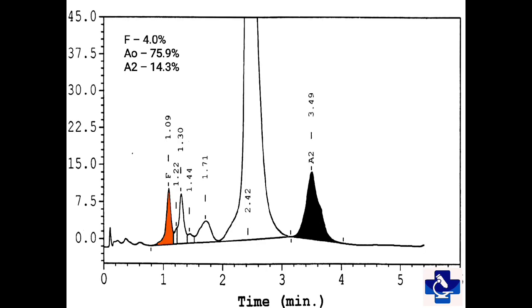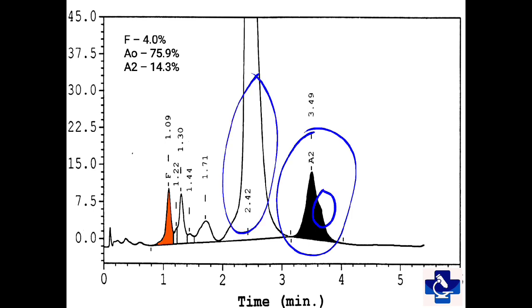In this slide, we can see that A2 is elevated at 14.3% with a bulge on the downward slope of A2. A0 is the major hemoglobin fraction at 75.9%, with slightly elevated fetal hemoglobin at 4%. This is the heterozygote hemoglobin Lepore.